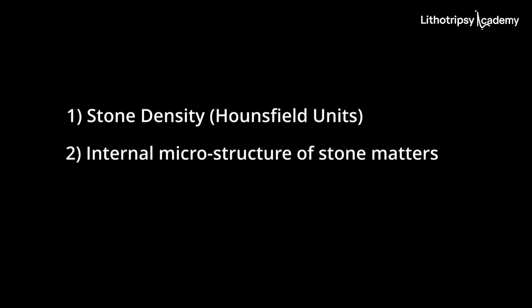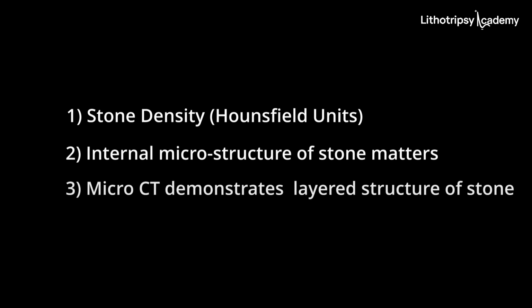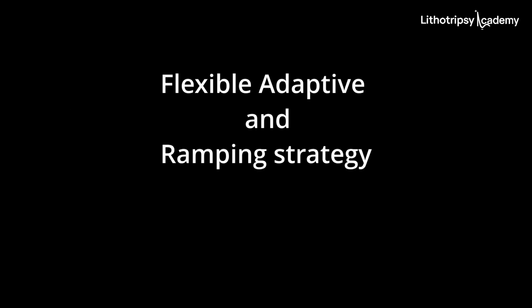What really matters is the internal microstructure of the stone. Modern imaging has shown us that cracks, layers, and mixed composition are what determine how shock waves propagate and where the stone begins to fail. This is why a flexible, adaptive ramping strategy is so important. We are not just matching energy to size or density, we are allowing the shock waves to explore the internal architecture of the stone and exploit its natural weaknesses. Understanding stone heterogeneity is what turns SWL from a mechanical procedure into a truly personalized treatment.